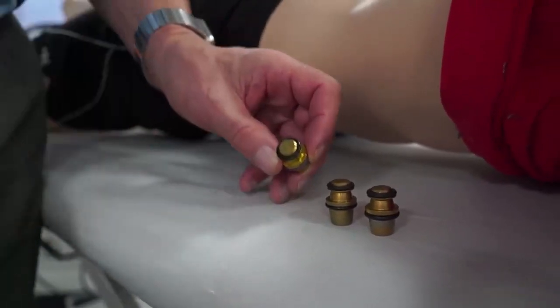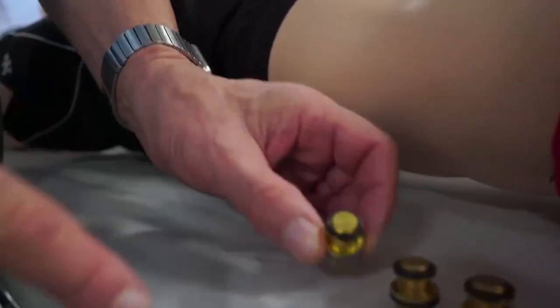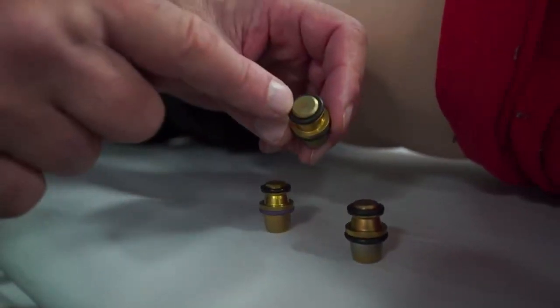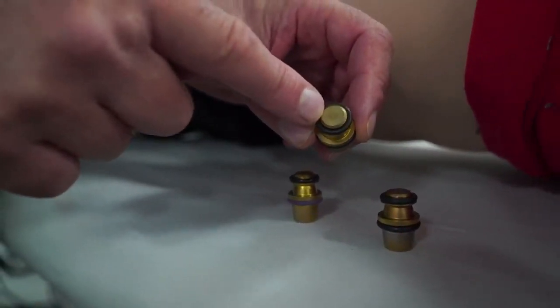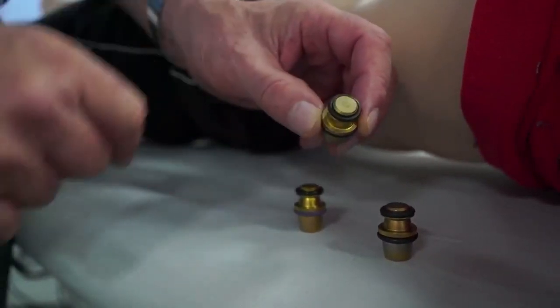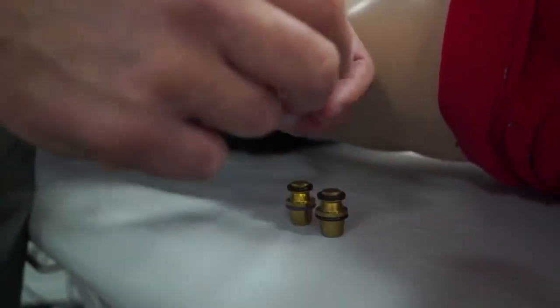Here is brand new. This is the good. On here, you'll start to see some wear where the transmitter has started to make an indentation. This is the bad. And this, to finish that analogy, is the ugly.